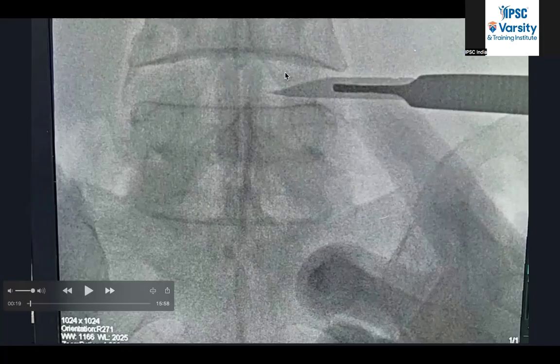So this is the entire area where we have the lateral recess and the herniation, and this is what we want to target. We want to open this area because we know the disc herniation is here. Somewhere here is the dural sac. So my incision would be somewhere over here, and I'll open this area to reach the fragment.